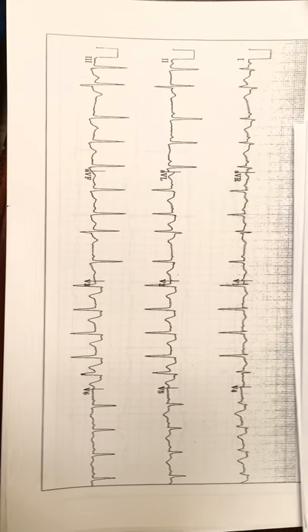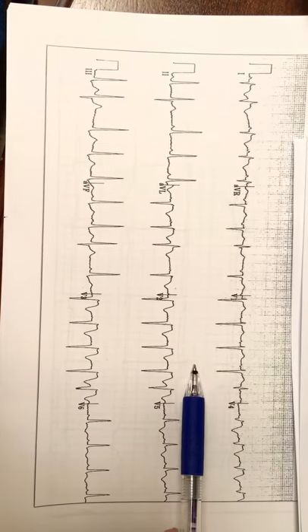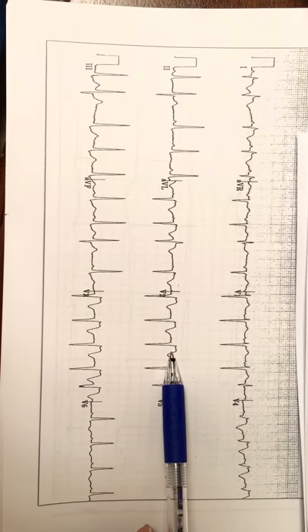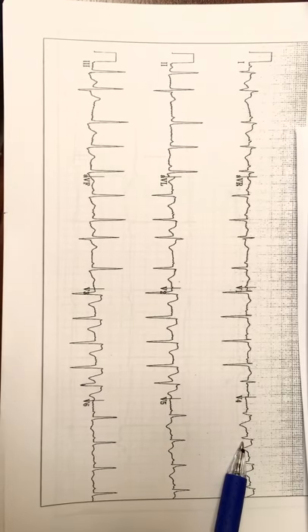The EKG was a STEMI that was brought in, and as you can see, it is definitely a STEMI. You have the ST elevation in V2, V3, and V4, which is fairly significant.